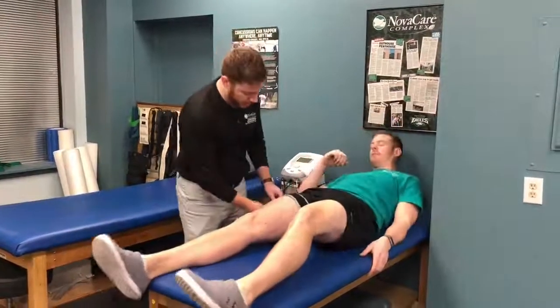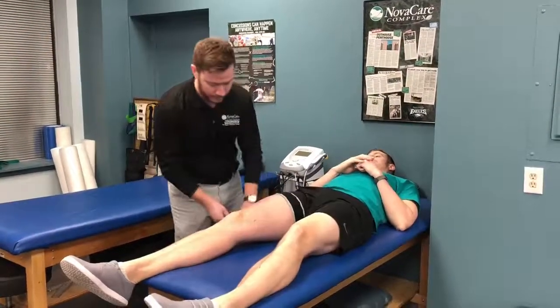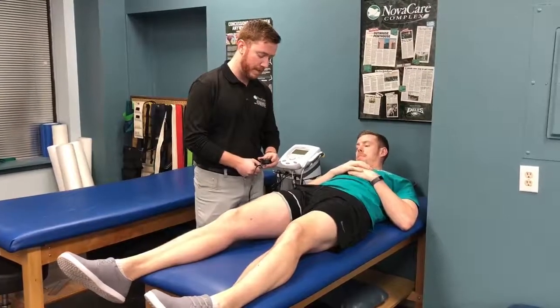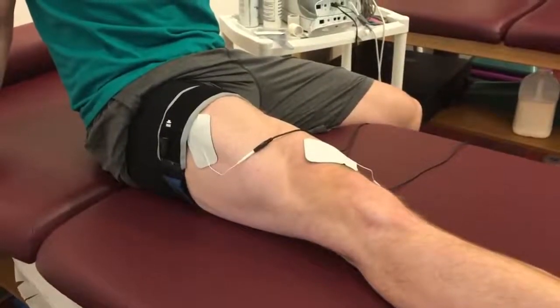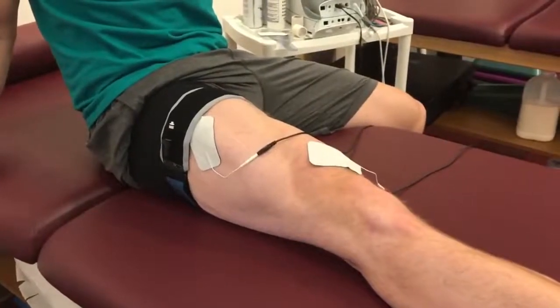What we do is we use something similar to a blood pressure cuff in order to occlude blood flow leaving the limb. While the cuff is pumped, it creates an anaerobic environment similar to when lifting very heavy weights. This is what allows us to make significant strength gains while performing low load exercises and protecting the graft at this early stage.